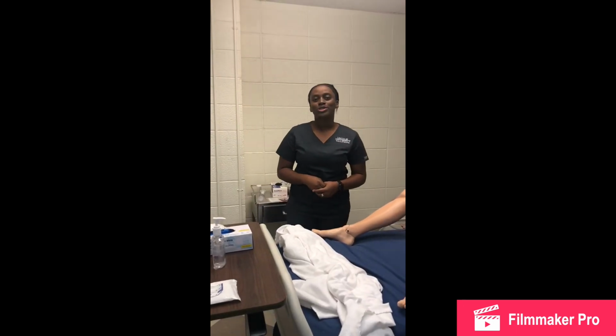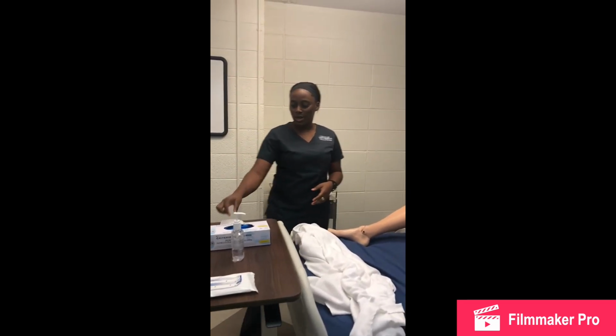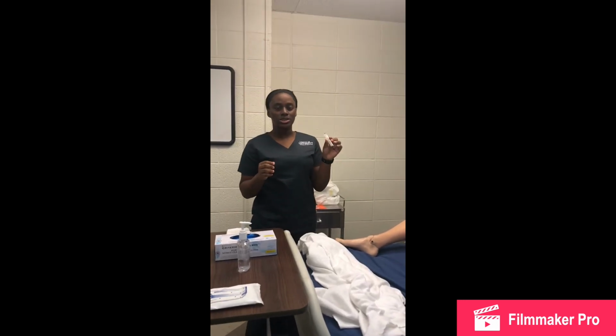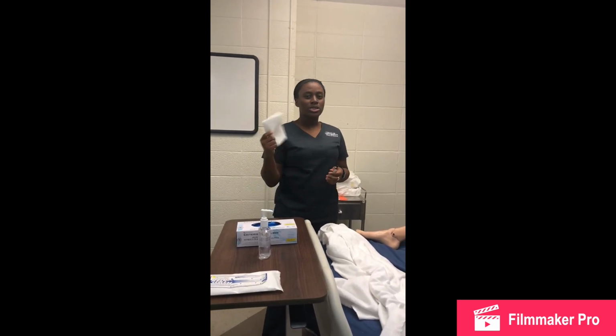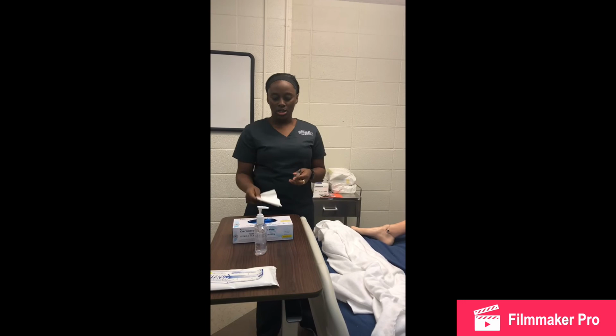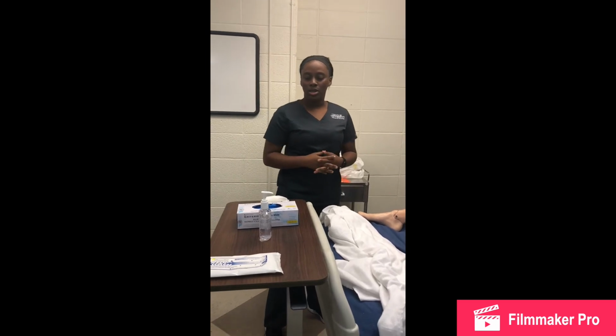So now I'm going to show how we carefully remove a Foley catheter, right? So I've got all my supplies that I needed. I need my 10 milliliter or cc syringe, because that's the amount of fluid that we inserted in the balloon. We're going to need an absorbent pad just in case the patient doesn't have one underneath them on the bed. We're going to need wipes if the patient's perineum area needs any cleaning, stuff like that.